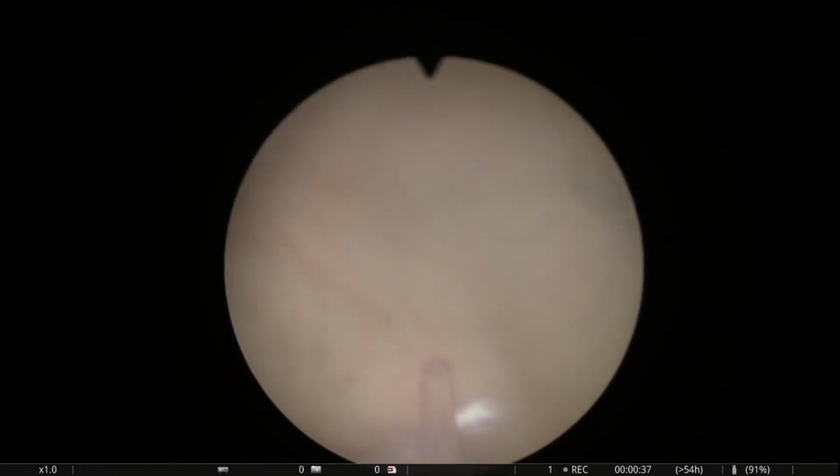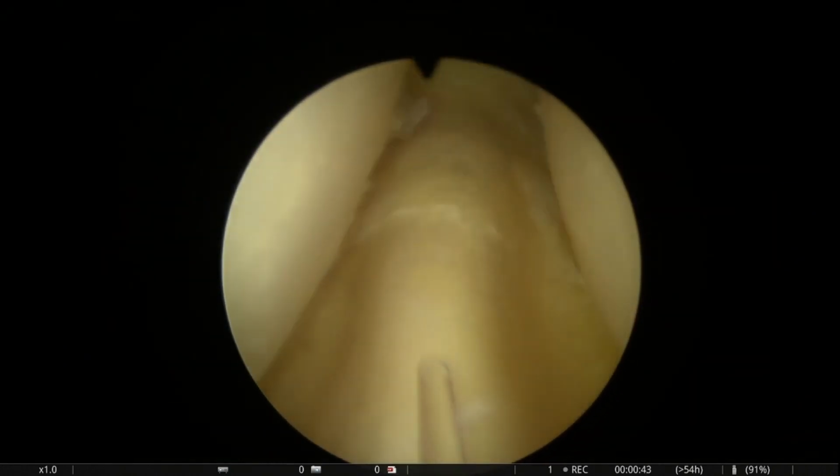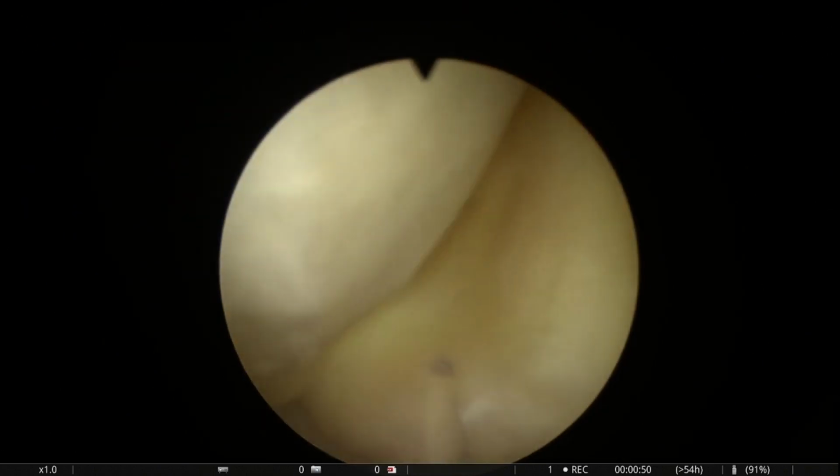Note that this model does not include that feature, but in practice, the trainee would identify them in a patient. The median lobe and verumontanum are identified next. The scope is pulled back to identify the external urethral sphincter, and the hypertrophy of the prostate is assessed.